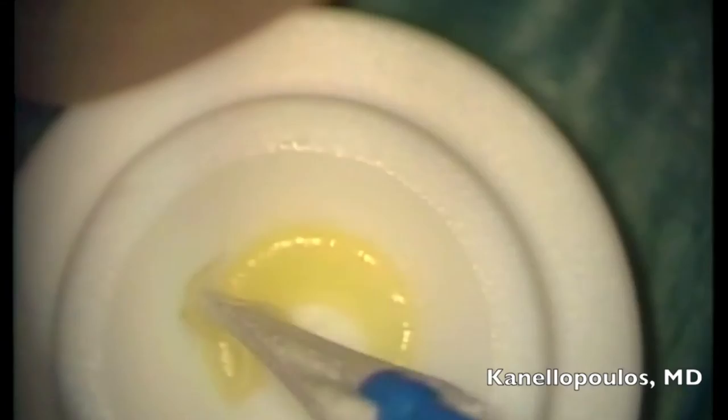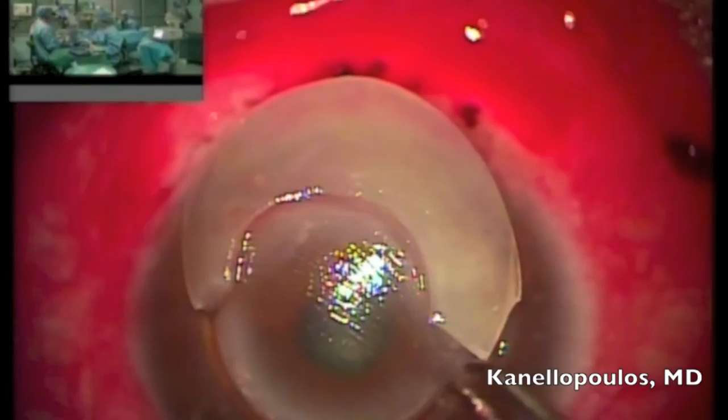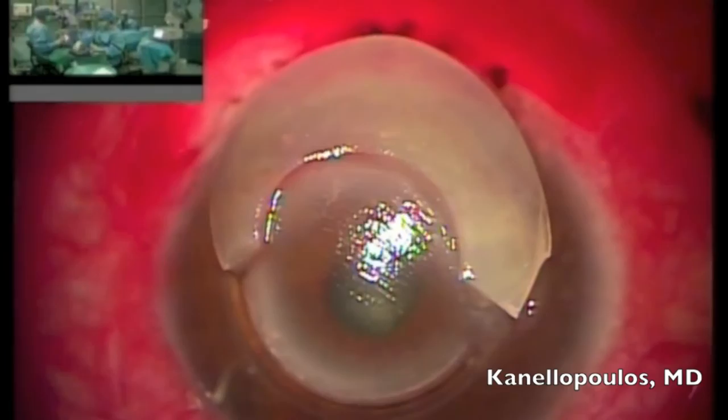I'm going to freehand using a 9-millimeter trephine to try and trim down this annular patch graft and create an initial version of it that will fit the defect created after we remove the debris from the melted cornea. Although this seems quite large, experience has taught me that after suturing it would probably be good enough, and we'll see during the procedure.